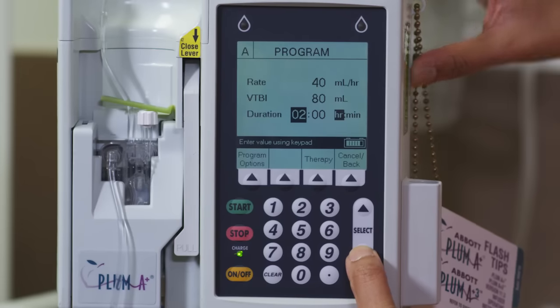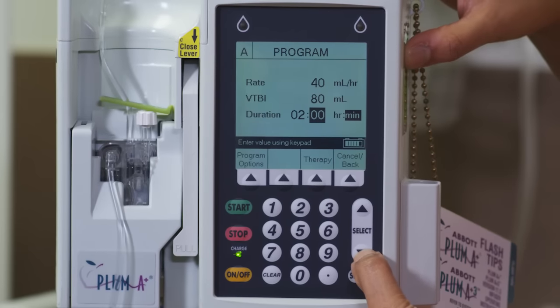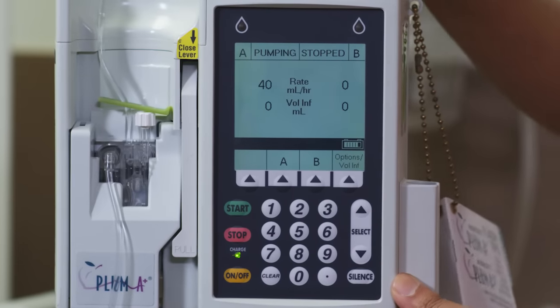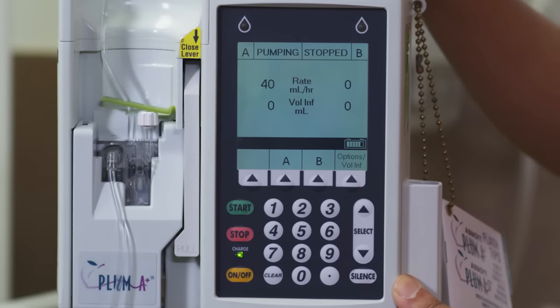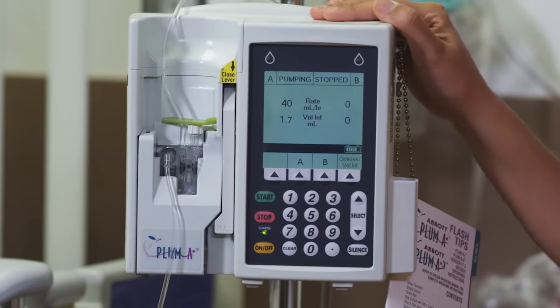If you want to change your hours or minutes later, just use the down arrow to go to the minute. Then push your start button. You'll see a blinking light on channel A, and that tells you that your fluid is running and flowing. That's your channel A, your primary line. Now let's go through common interventions that you may do with your pump.